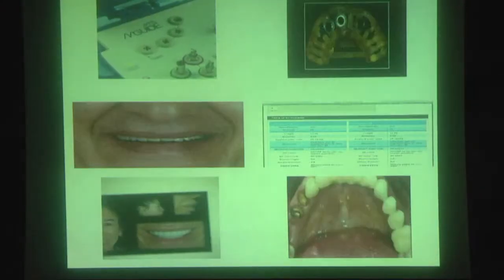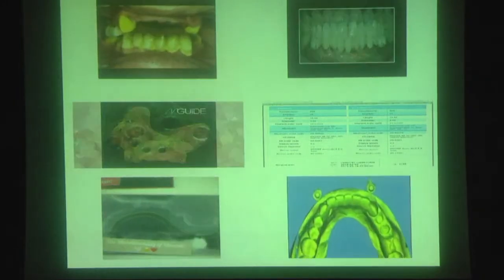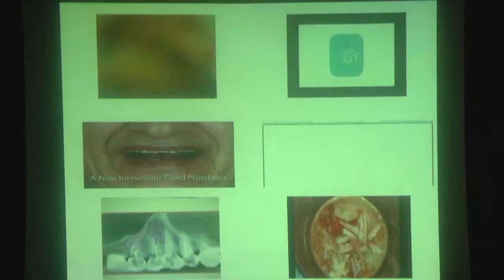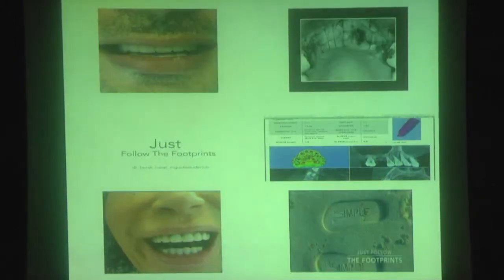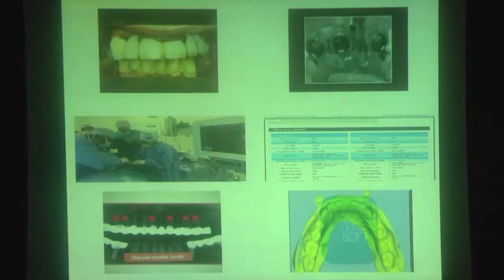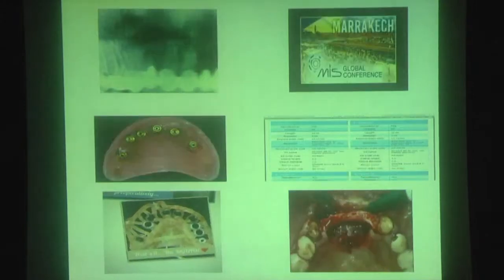So when I first started using guided surgery, maybe 6 or 7 years ago, I mean, I have dealt with guided surgery for over 10 years, but I have used the M-guide system for more than 6 years, and I had so many friends saying, oh, doctor, what did you bring to my life? I don't want to use a guide because I want it open. I like the bone. I like the sensitivity. I like to touch the bone. I like proprioception. No need to place one implant.